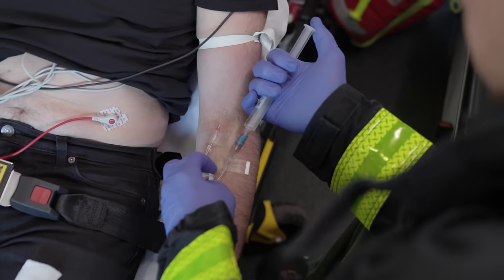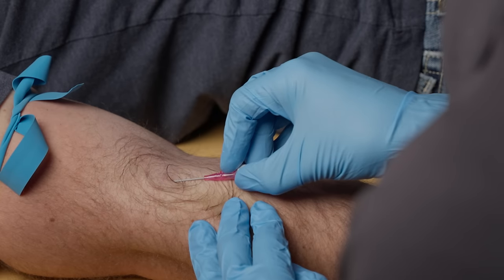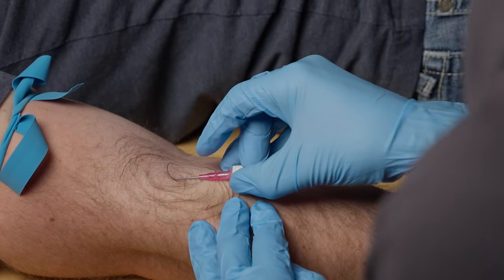In this week's video I'm going to go through all the supplies you need to start an IV and then I'm actually going to demonstrate the procedure to give you an idea of how it works.